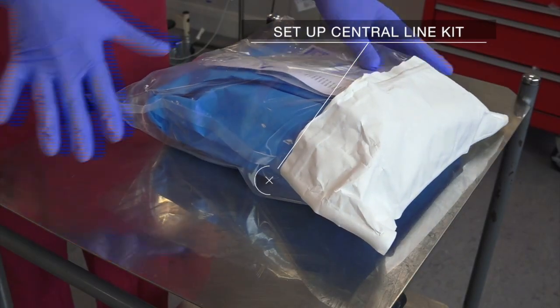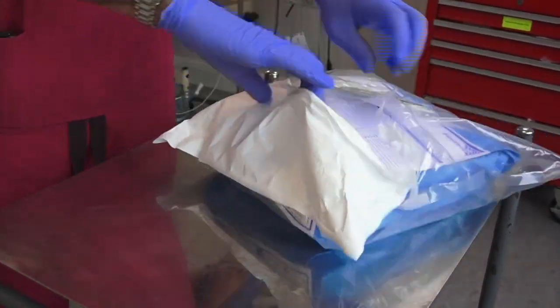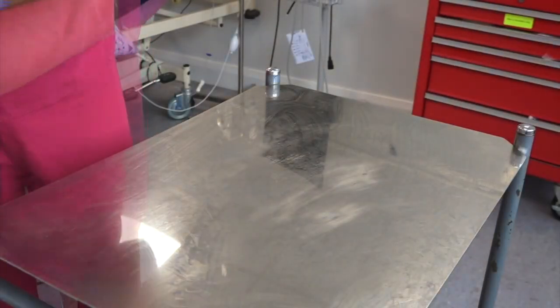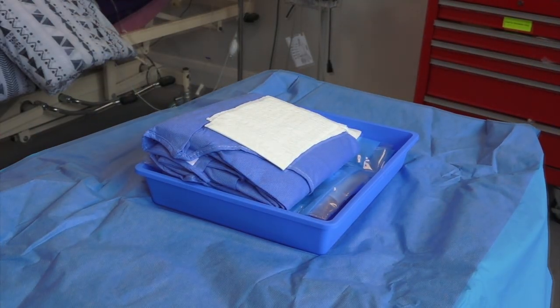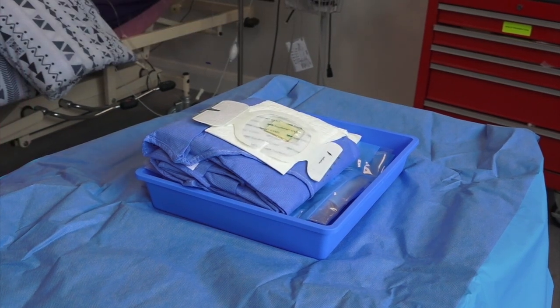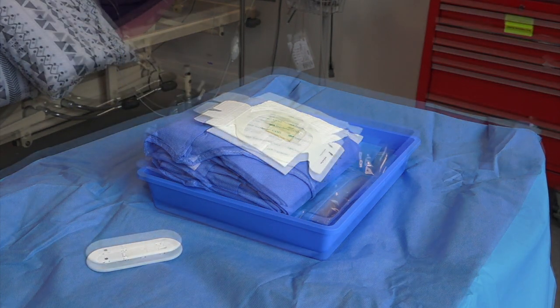Set up a pre-made central venous cannulation kit by opening it aseptically on a clean trolley. This kit should contain an antimicrobial impregnated dressing, a suture, as well as a sterile gown and hat.